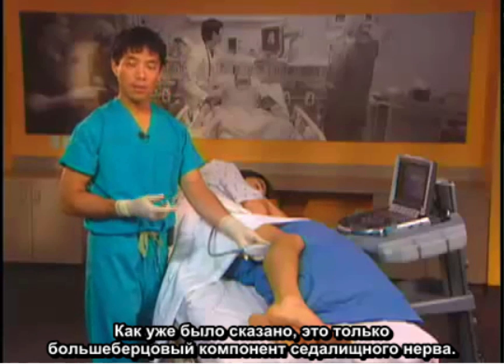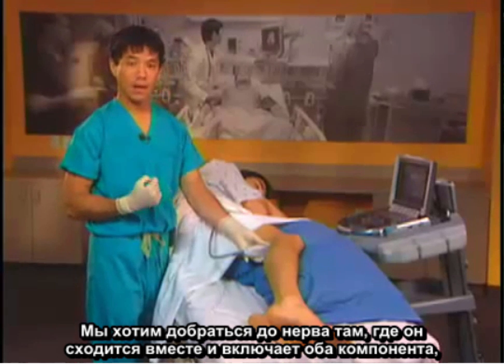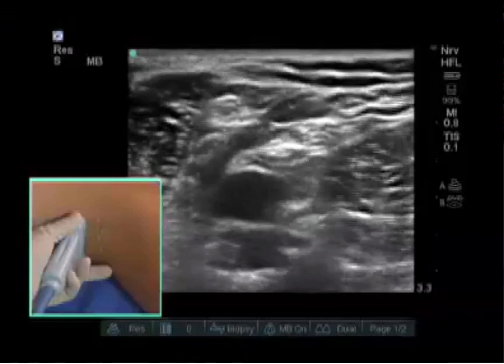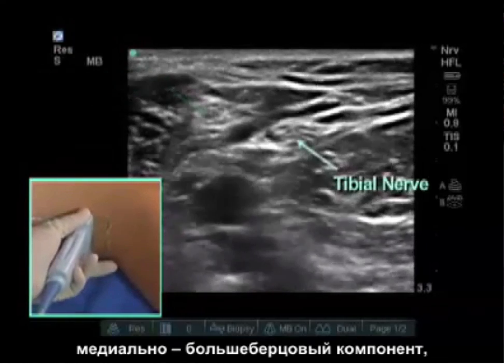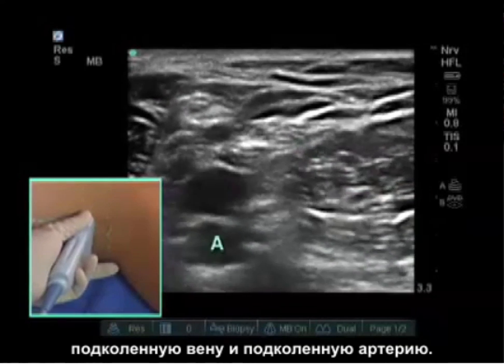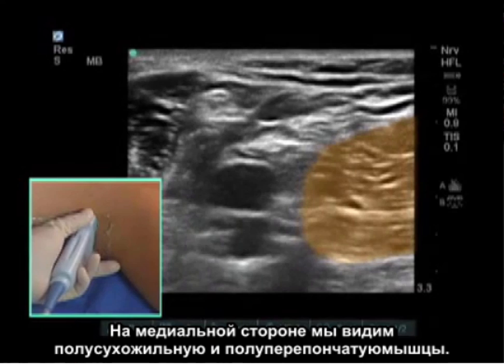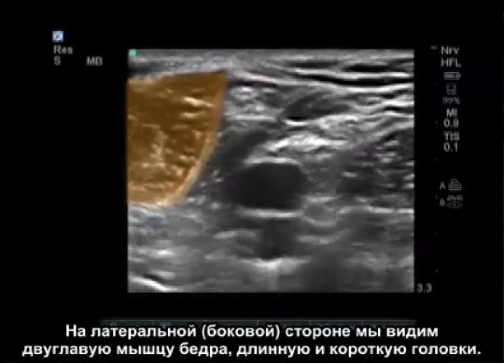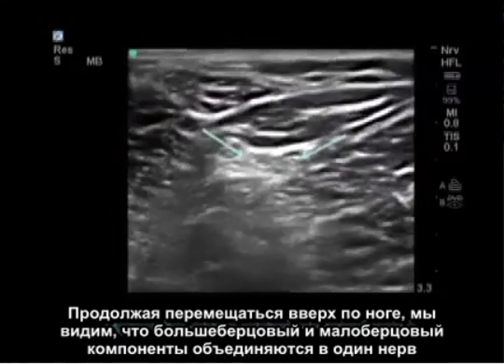As mentioned, at the level of the knee we are only seeing the tibial component of the sciatic nerve. We want to get the nerve where it comes together and has both components — the peroneal and the tibial. As we scan up the leg, we now see the peroneal component laterally, the tibial component medially, the popliteal vein, and the popliteal artery. On the medial side we see the semitendinosus and semimembranosus muscles; on the lateral side we see the biceps femoris long and short heads.